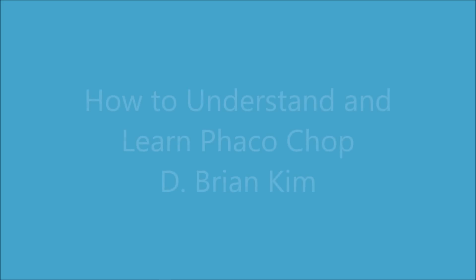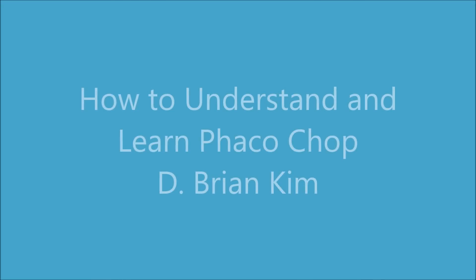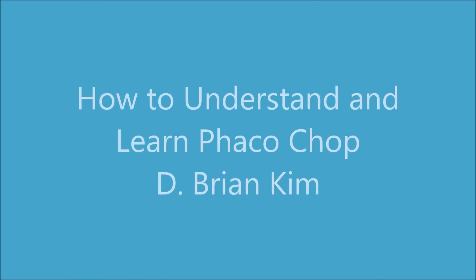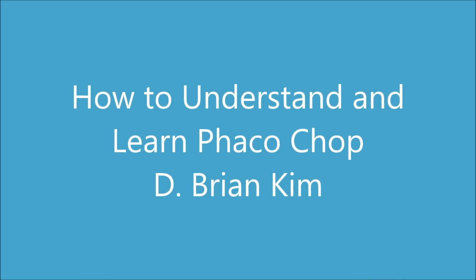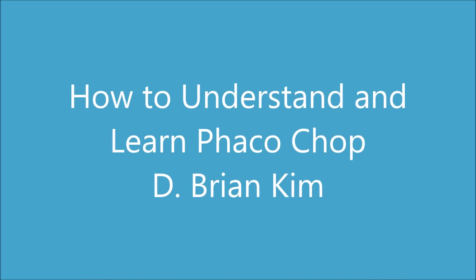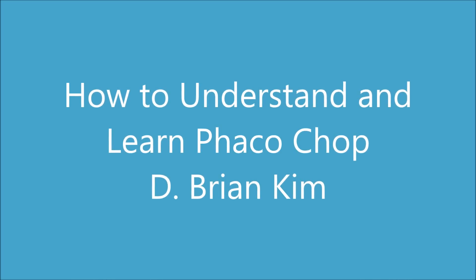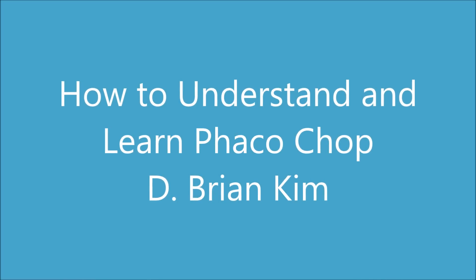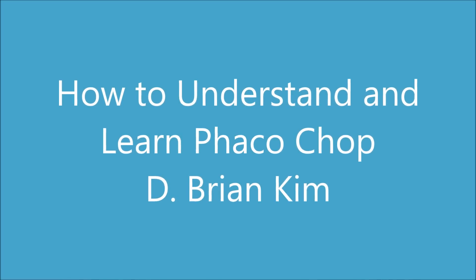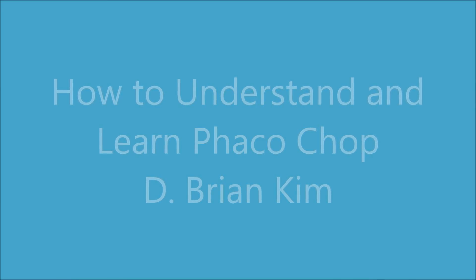Hello, my name is Brian Kim and I'd like to share my technique on FacoChop. I truly believe FacoChop is the best technique because it is simple and it is efficient. I learned how to divide and conquer during residency, but I soon realized sculpting is inefficient and increases risk to the intraocular structures, including the cornea. My FacoChop technique has evolved over the years and I'd like to share this with you and hopefully you'll learn something new.